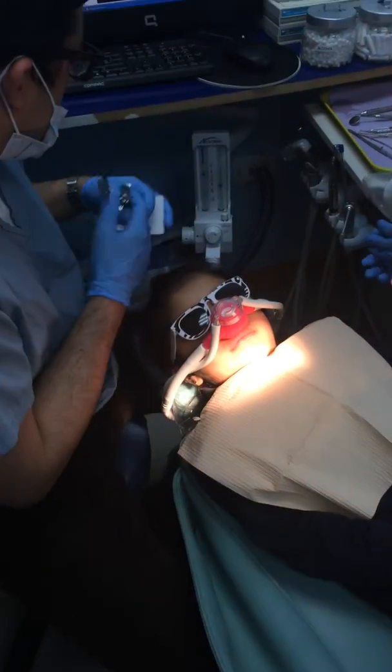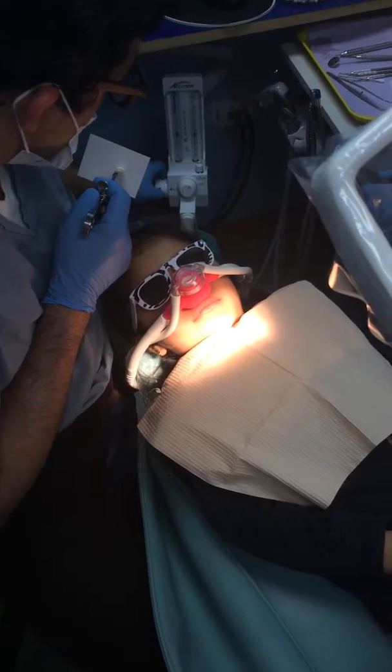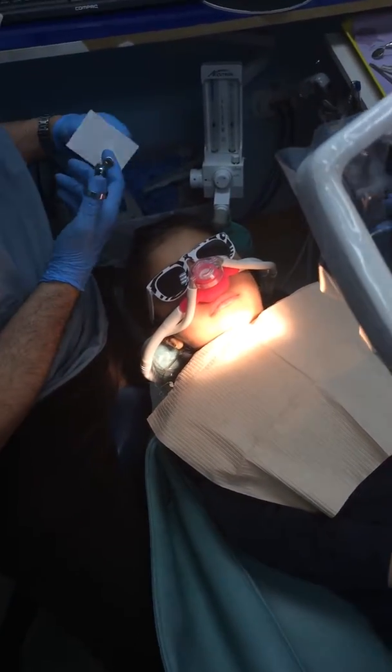She just doesn't want to get pinchy-pinchy. She's about 40% nitrous and she's very happy with that, so that certainly can help us.